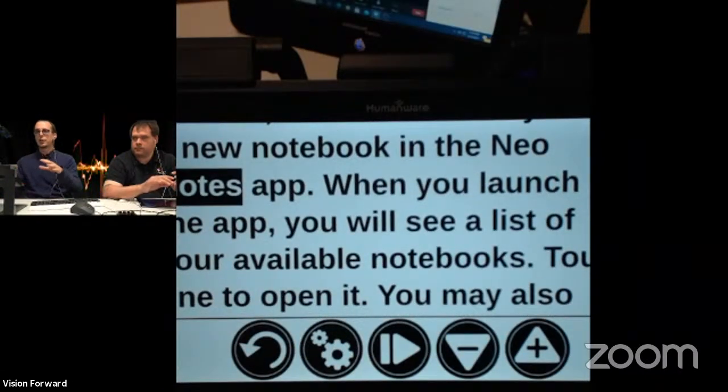And you guys can't see the entire width of the screen, but all the words are being displayed. It's reading to us, it's highlighting. But even in this mode, where it's displaying it, it's not showing us the page anymore. It's taken the words and put them onto the screen. And as we magnify here, it will wrap the words to the width of the screen.